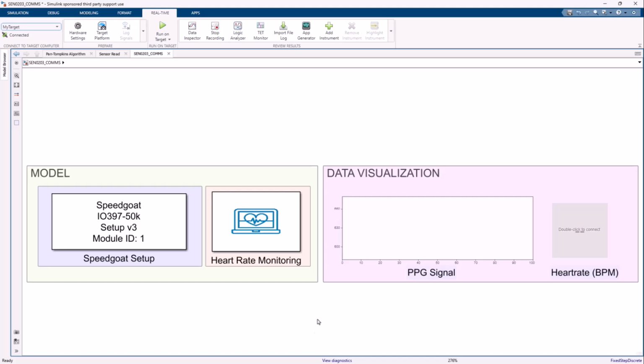First, we want to read the analog signals from our PPG sensor into Simulink using Speedgoat hardware. I'm going to show you how to do this step by step in a bit. Now, once we have the raw signal, we will then process it. For this example, we will simply adapt the Pan-Tompkins algorithm. Once we have our processed signal, we can then calculate the heart rate to then visualize the data in real time. So here is our Simulink canvas.